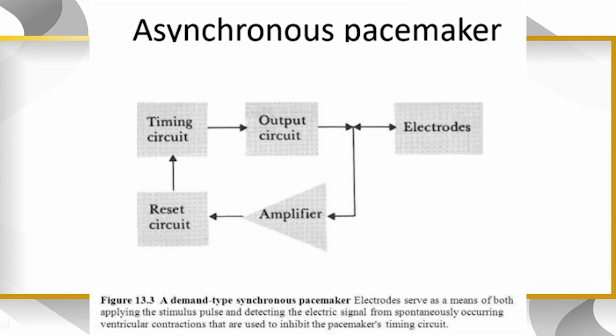Demand pacemaker, timing circuit of a fixed rate of 60 to 80 beats per minute, but it takes the feedback and it resets according to the response. Pacemaker is in standby mode if a normal heart contraction occurs within a fixed time.